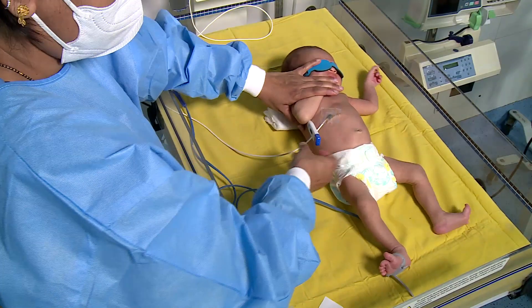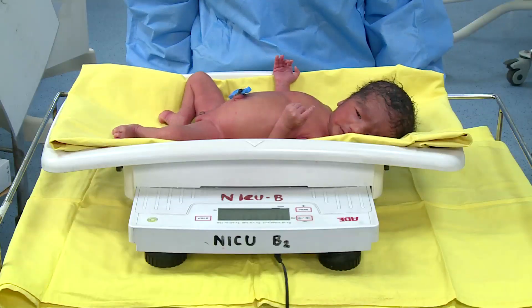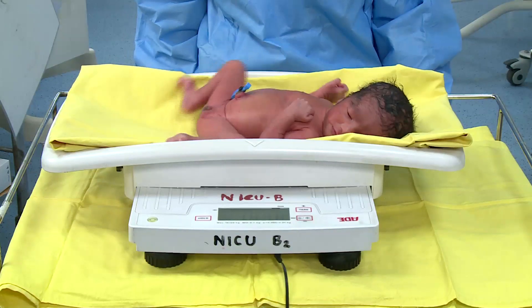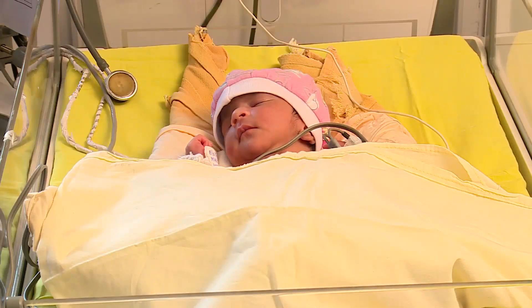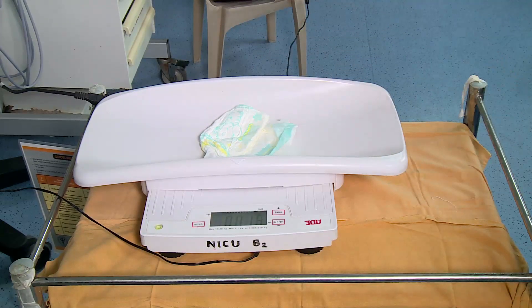Monitor the baby's temperature every two to four hours, or more frequently if there is fluctuation in temperature, and record it. Check the weight of the baby daily. Ensure that the baby passes adequate urine — that is six to eight times per day — or record napkin weight.